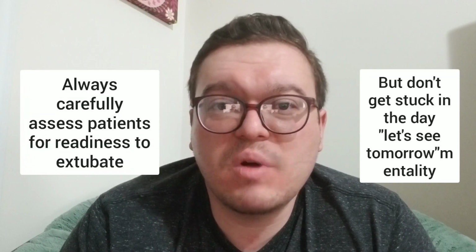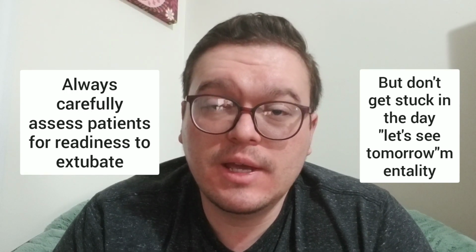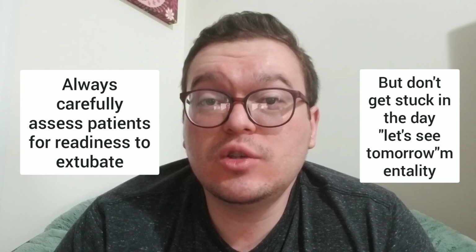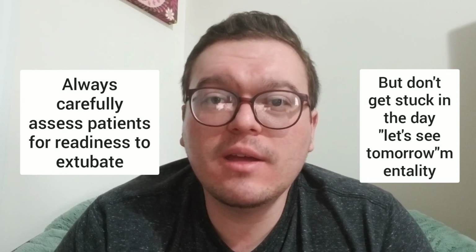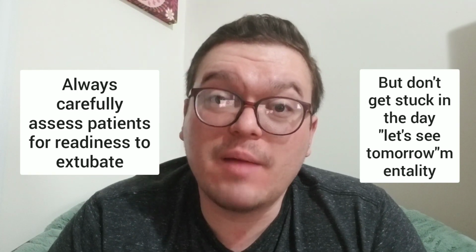Again, this is something that you'll pick up with experience, and every patient behaves differently, so you will need to be ready to be surprised. You may expect one thing, and your patient may need to be reintubated. Also remember, you don't need an absolutely perfect patient for extubation. If you look at the literature, if you don't reintubate 1 out of every 6 patients that you're extubating, you're probably waiting too long to extubate. That just means you're too cautious. So you may be keeping patients unnecessarily too long on a ventilator because of apprehension.